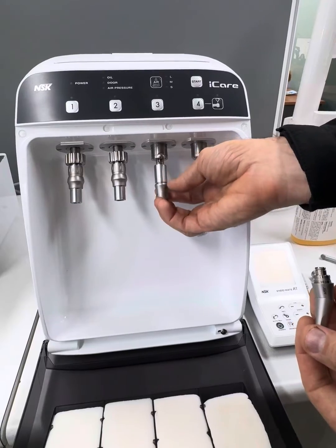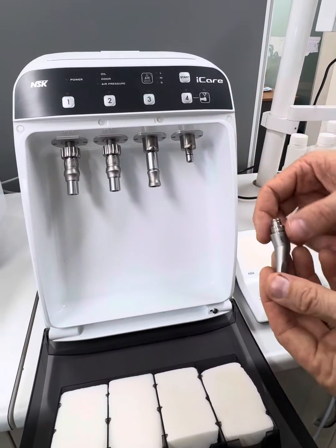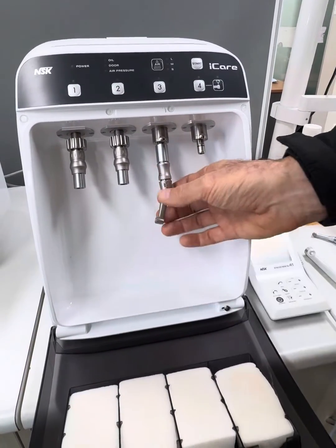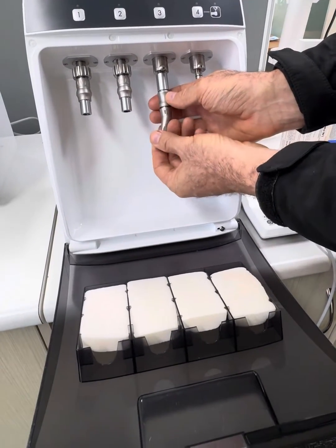Now, really conveniently, this just clicks straight onto one of our low-speed lubricating lines, and then we've got a little shroud here. We just pull that back, push it in, and then that locks in. Now, obviously you need to be gloved in the sterile room — this is our showroom, so everything's clean.